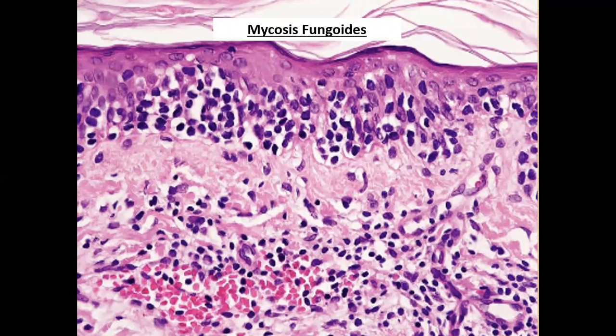If there is epidermotropism but with normal looking nuclei, then it cannot be called mycosis fungoides. So to call it mycosis fungoides, the requirement is the presence of epidermotropism with lymphocytes surrounded by a clear halo, and lymphocyte nuclei should be of abnormal sizes and shapes, showing pleomorphism.